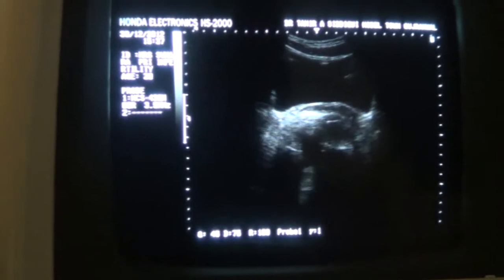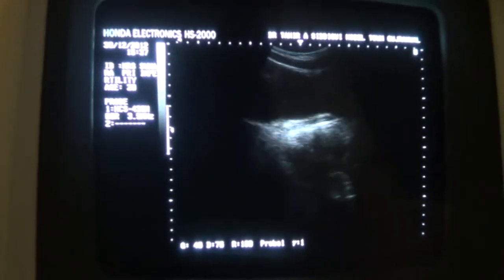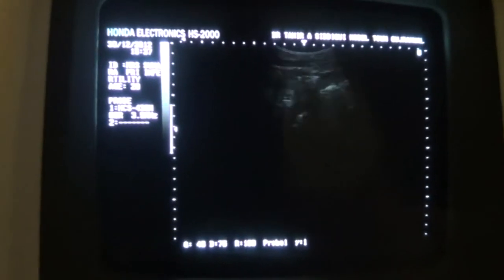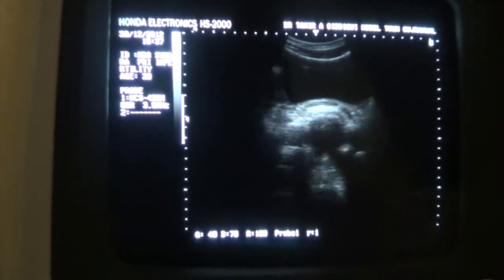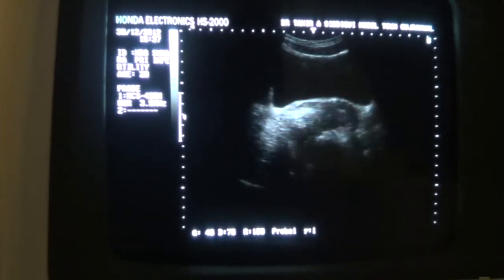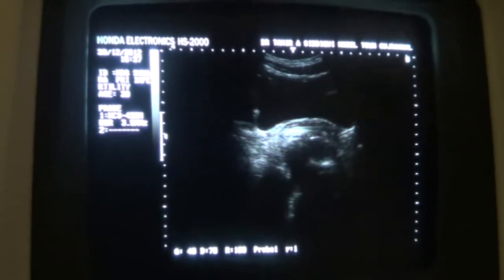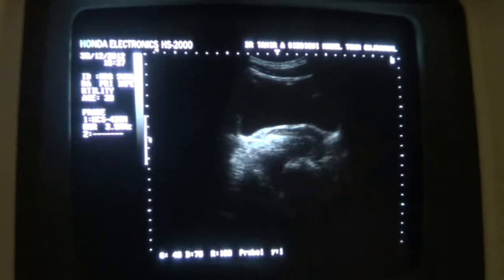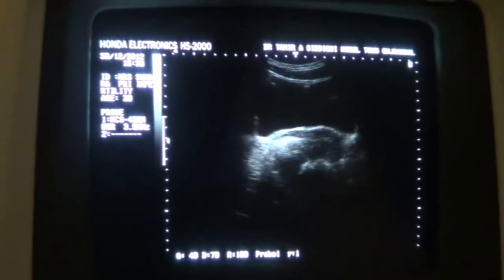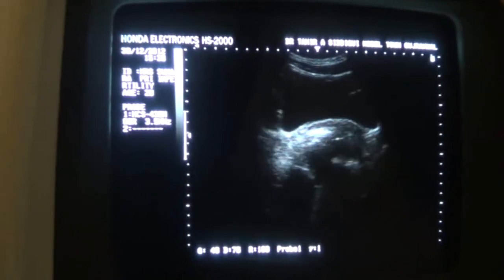Married one year. Here we are seeing the urinary bladder, which appears to be adequately filled in transverse sections.